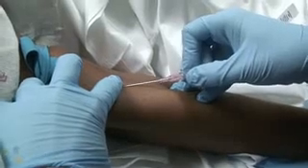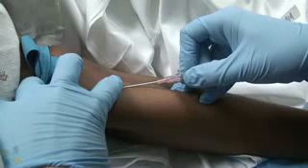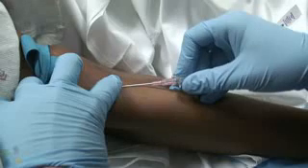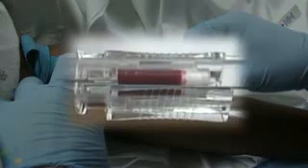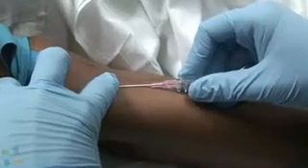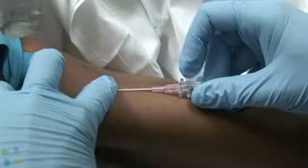Insert the catheter parallel to the course of the vein, at an angle of 10 to 30 degrees to the patient's skin. Puncture the vein with firm pressure and watch for the flash of blood within the catheter. Once the flash of blood is seen, flatten the angle of the needle and advance 1 to 2 millimeters to ensure that the needle tip is fully within the vessel.